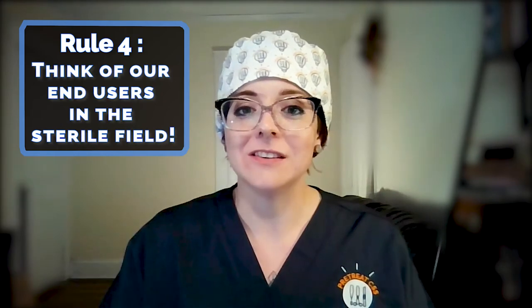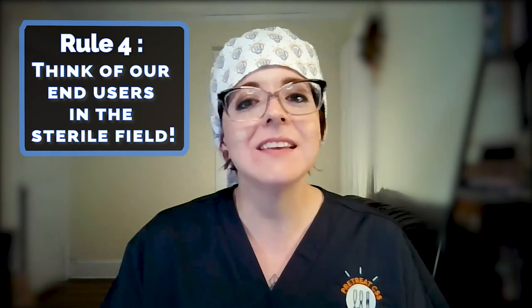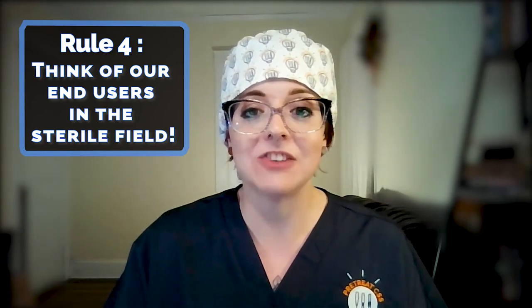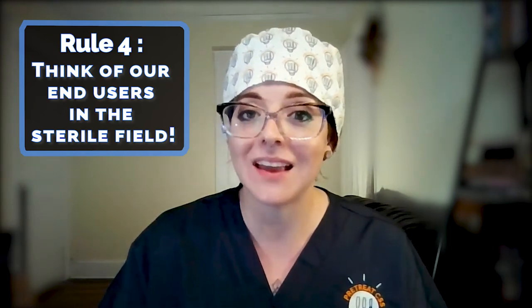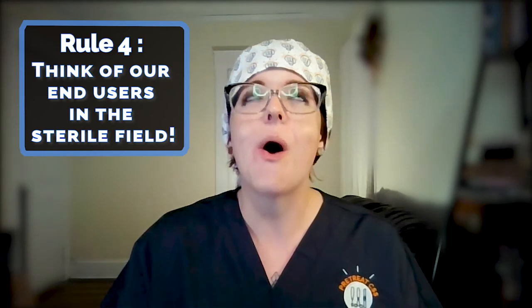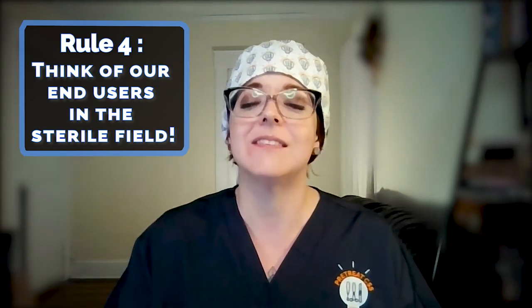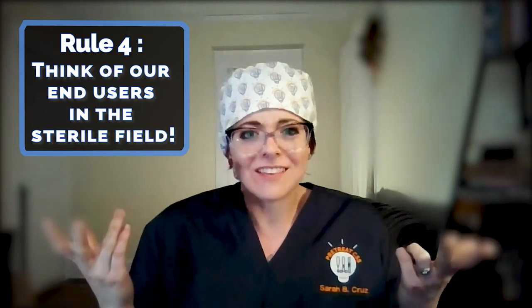4. Think of our end users in the sterile field. We have to take aseptic technique into consideration. The ANSI, AAMI ST79, and AORN all have guidelines and recommendations that pertain to the proper covering of instrumentation to maintain sterility. And let's not forget the Association of Surgical Technologists, AST. All periop professionals are charged with executing aseptic technique consistently. Let's be sure to set up our patient safety professionals for success.